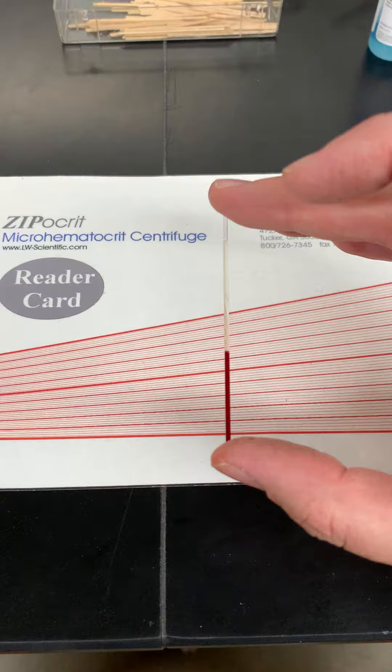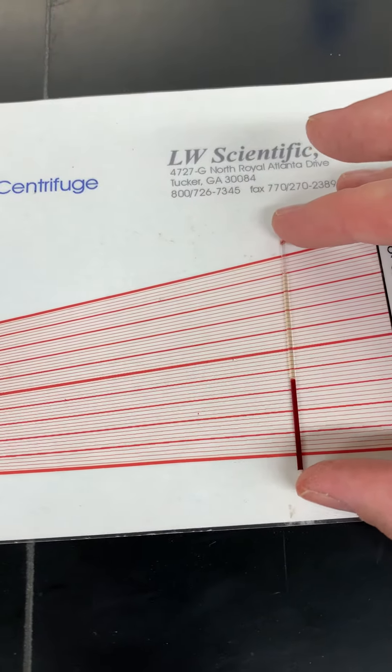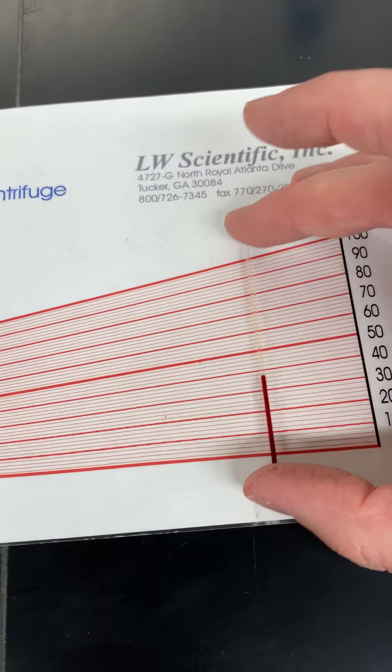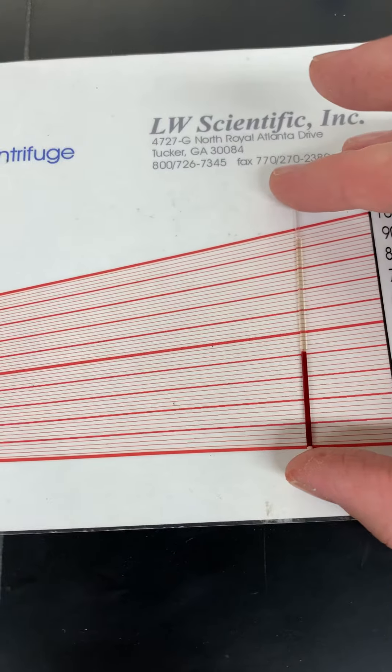You're gonna take this and line up the bottom of the red blood cells with the zero mark and the top of the plasma with the 100 mark, and then read where the red blood cells end. And this is easier said than done while you're talking and holding a camera.